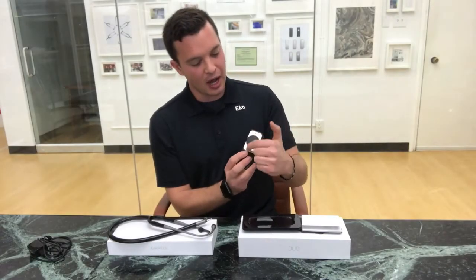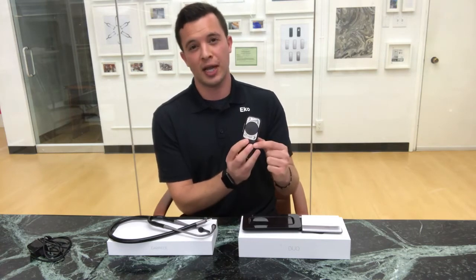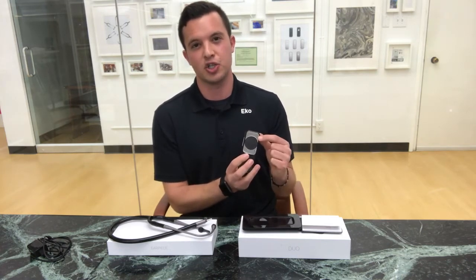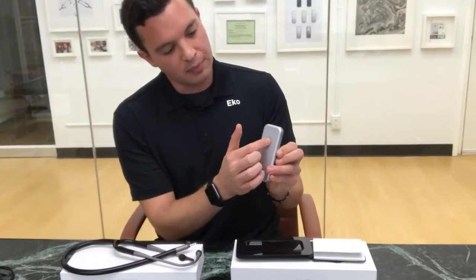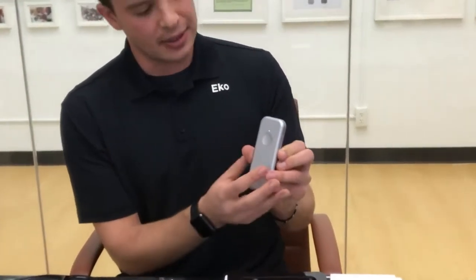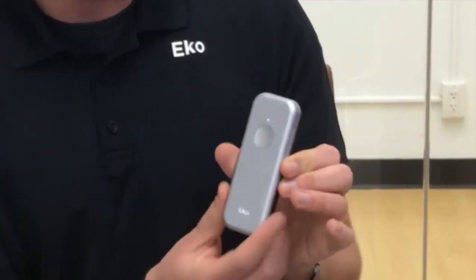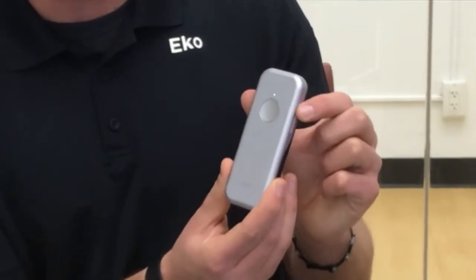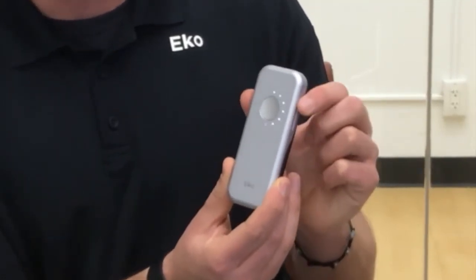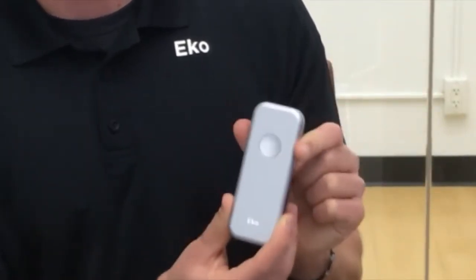The ECHO DUO on the back side has a digital stethoscope diaphragm and two electrodes that make up the one lead ECG. On the front side is a single control button that when pressed down will turn on the stethoscope and illuminate a ring of LED indicator lights. To change the volume, simply switch the volume toggle on the right side of the DUO up or down and the associated volume level will be displayed via the LED lights.